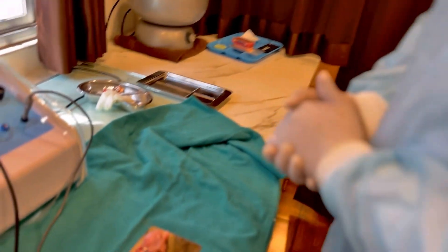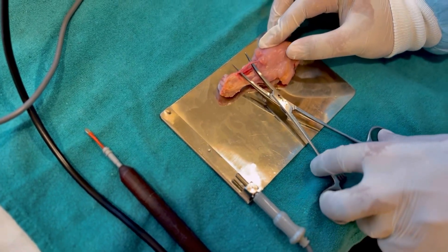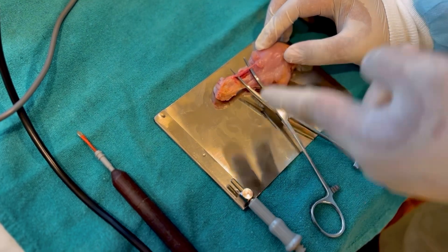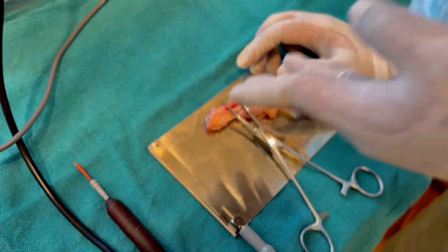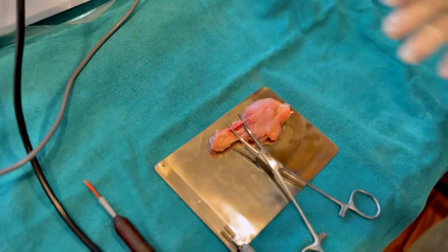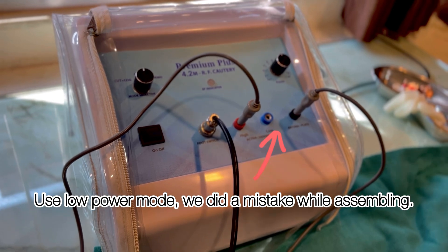We will start with our demonstration. Here we have taken a chicken leg and we have isolated the blood vessel, which we will cut into and then try to ligate or cauterize. For cauterization we are using a radio cautery.